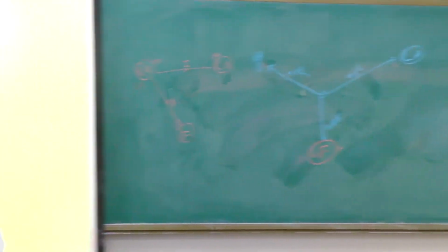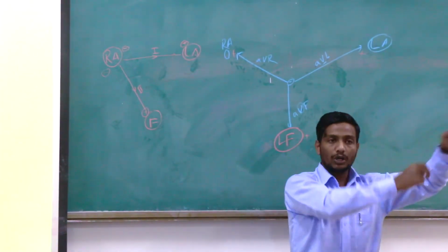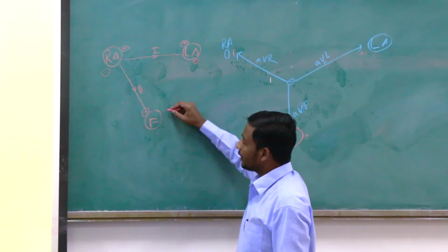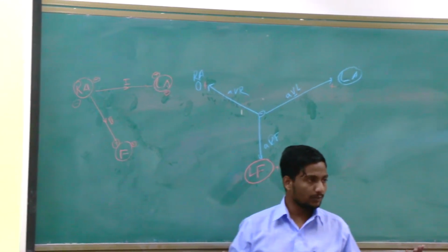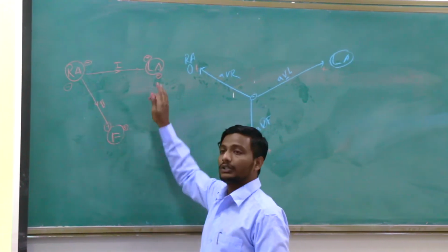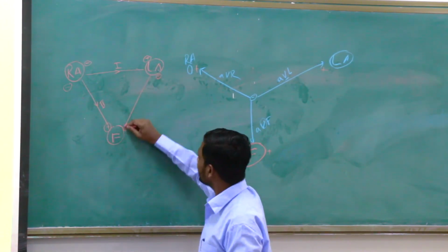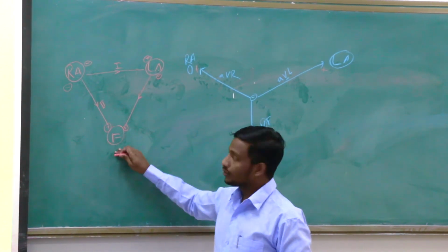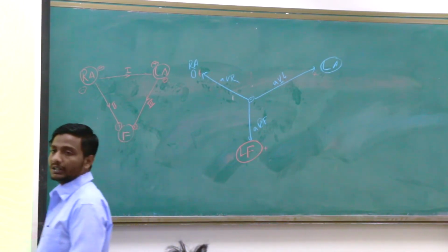Clear? Yes, sir. Okay. Now let's go for the left side. When the left arm and the foot are going to work together, the left arm is going to behave as negative, and the foot is going to behave as positive. It is already designed. This is not ours. This machine has already been designed in such a way that when these two are working together, this will behave as negative and this will behave as positive. So now you tell me what is the direction? Left arm to the foot. So this one has been given the name lead 3. So we call it lead 3.